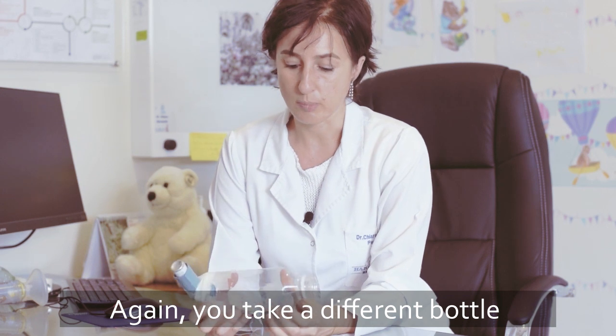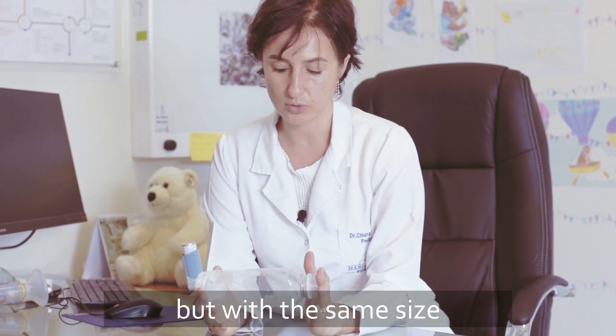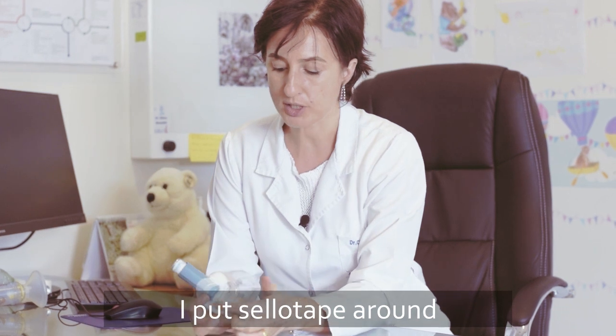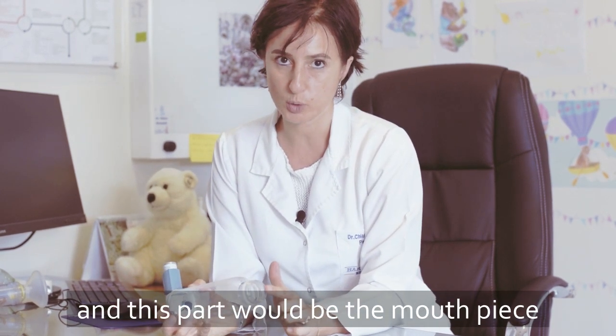Again, you take a bottle. I choose a different one. The size must be more or less the same, 500 ml. I made a hole at the base where I put the spray. I put sellotape around to prevent the air leakage, and this one would be the mouthpiece.